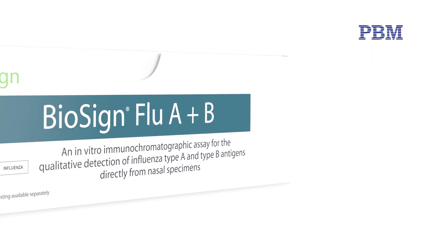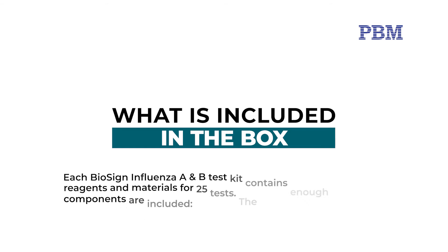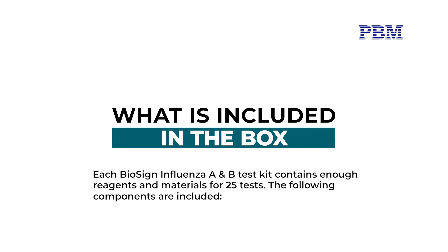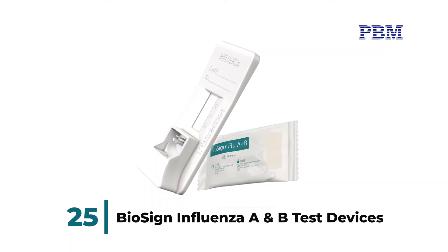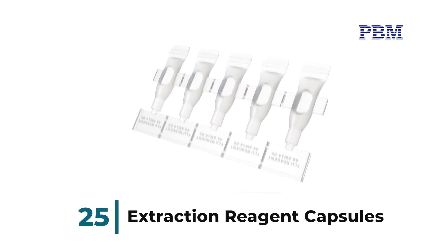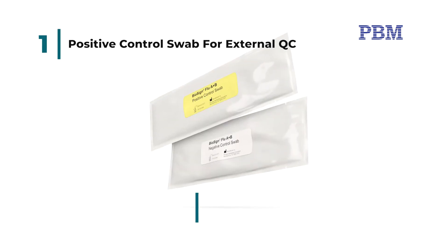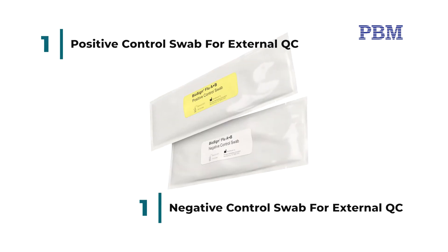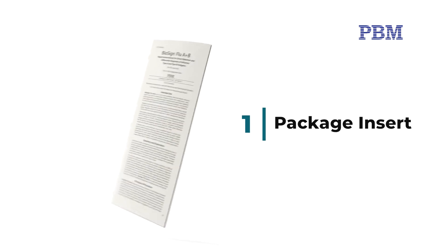Each BioSign Influenza A and B test kit contains enough reagents and materials for 25 tests. The following components are included: 25 BioSign Influenza A and B test devices, 25 extraction reagent capsules, 25 Phlox specimen swabs, 1 positive control swab for external QC, 1 negative control swab for external QC, 1 package insert, and 1 procedure card.